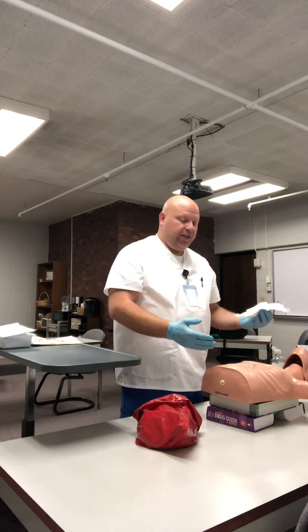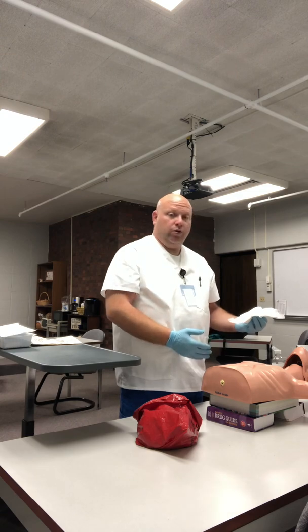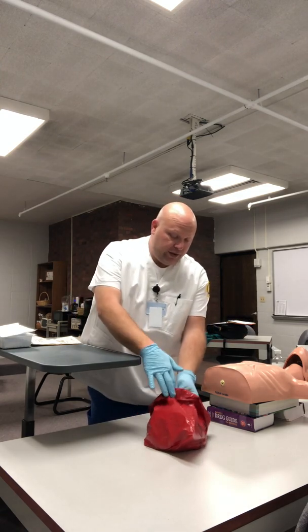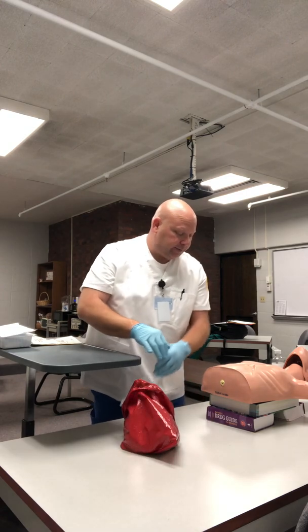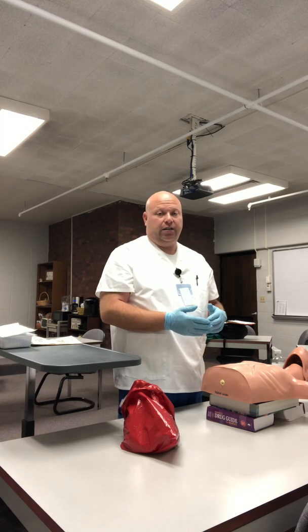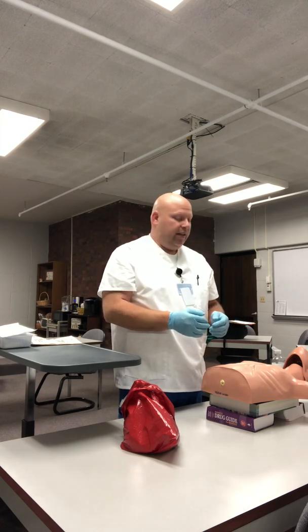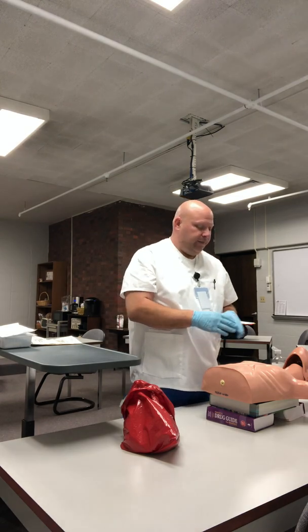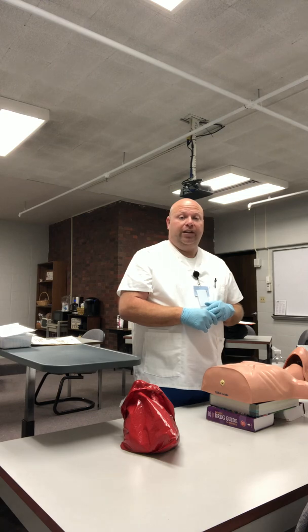Also, I want to assess the wound, make sure that there are no drains in it. There is none in these. I'm also going to throw this away in my biohazard bag. I want to look at the sutures or the staples, if the patient has them. I want to make sure that they are intact and there's no pus or anything draining from them. So Mr. Smith's looks good, so we will proceed to clean and reapply a sterile dressing.